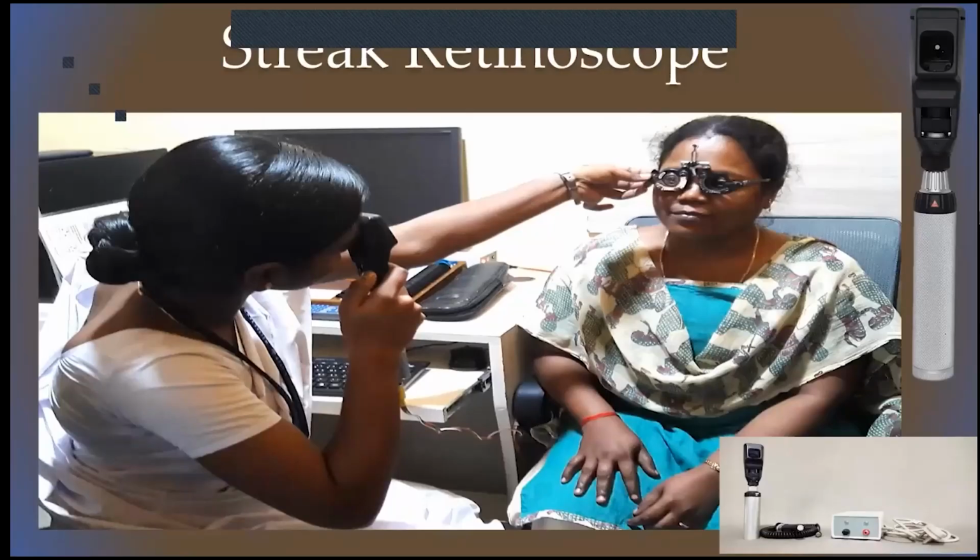So let me continue the session. First, we'll start with the Streak Retinoscope. It's the simplest equipment in ophthalmology, we can say. Every refractionist, optometrist, and other technician has this Streak Retinoscope. It's a handheld monocular device.